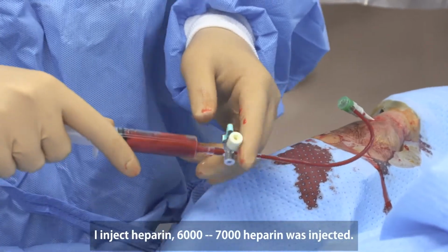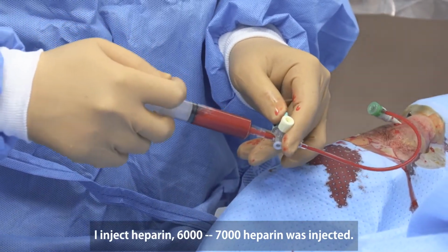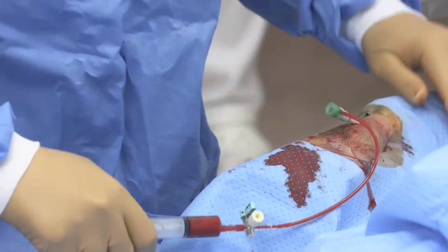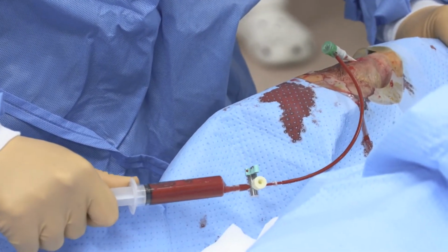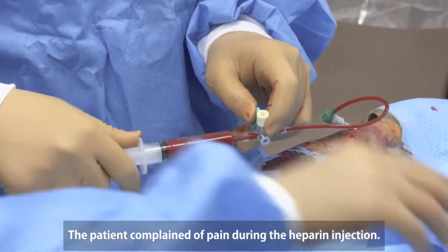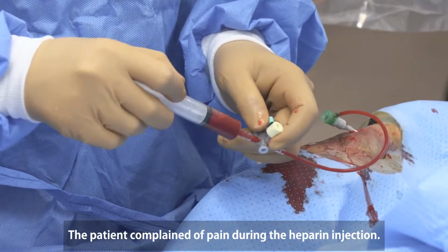I inject heparin 6,000. 7,000 heparin was injected. Patient complained of pain during the heparin injection.